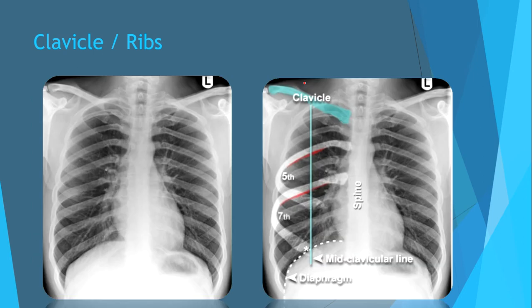Clavicle and ribs. So here we see the clavicle and ribs. This is background.